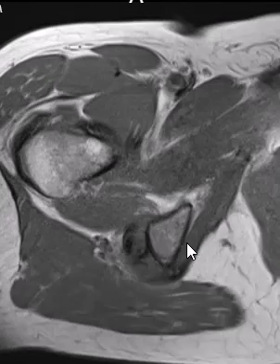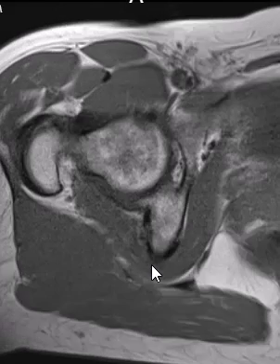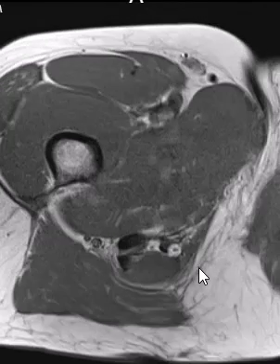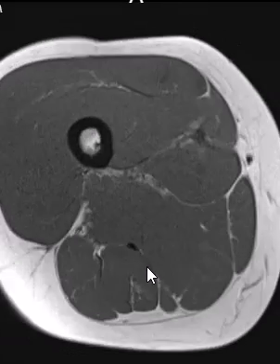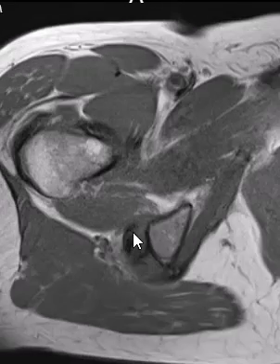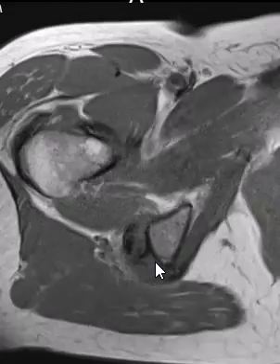On the T1 sequence, we can see the gray thick tendons at their attachment, partially torn. We're going to follow this biceps tendon — it forms a nice dark tendon coming down. We watch it go medial — it starts lateral and goes medial. We follow it back up.